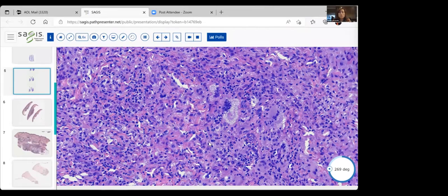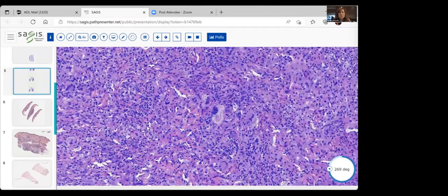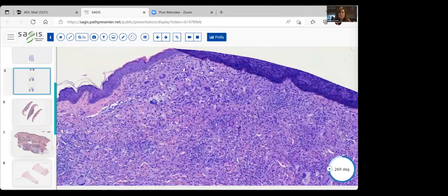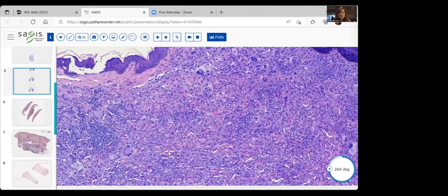Now, I want to show you what some of these big cells look like, particular to xanthogranuloma, but also seen in a few other things like NXG. Here you have multinucleation of the histiocyte and foam. So everybody see that here, here, and here, but you start to see that there's a very interesting pattern to this large cell. When I'm looking for this condition and looking for special cells on the edges, I look at the top of the lesion and the sides of the lesion. And I think you all can see that we're finding some very large cells in this xanthogranuloma.